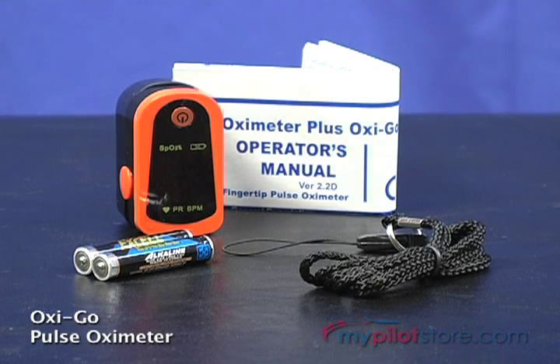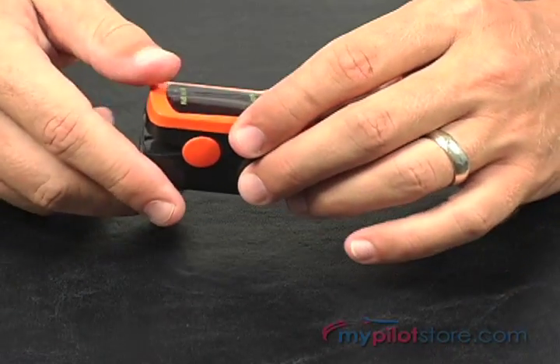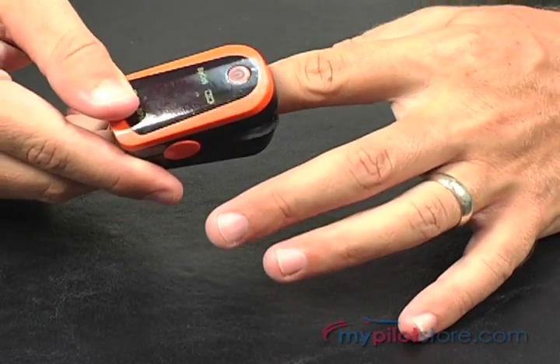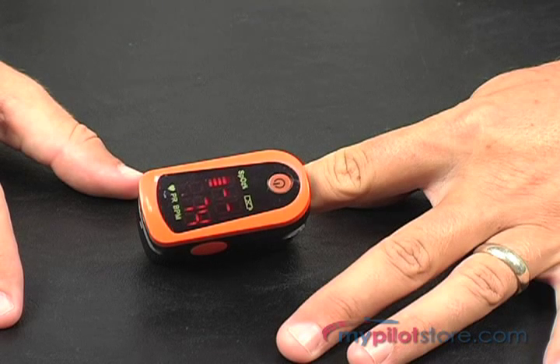This is the OxyGo pulse oximeter. The OxyGo is a fast and easy way to measure blood oxygen saturation so you can avoid the onset of hypoxia before it occurs. Using this device is simple — all you need to do is open the clamp and insert one of your fingers into the rubber hole. Press the switch button on the front panel and your results are displayed within seconds.